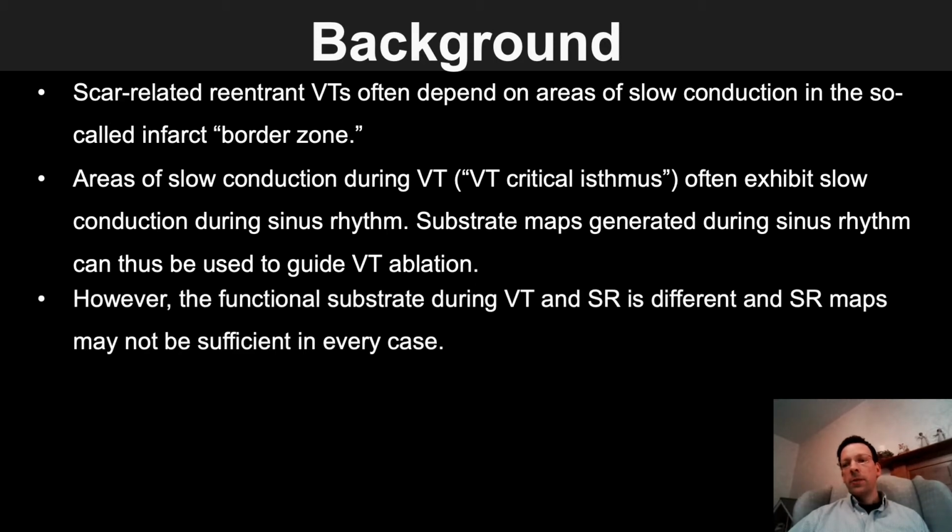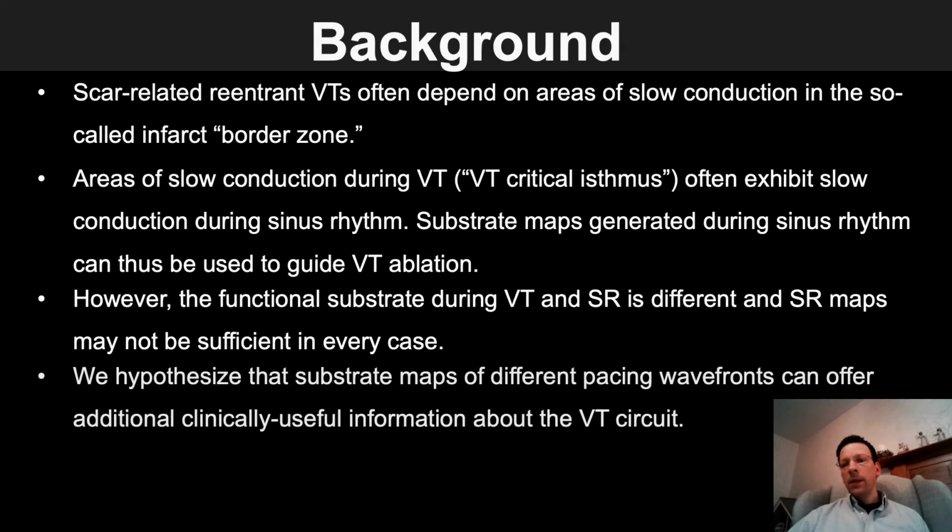However, the functional substrate is qualitatively different during VT than during sinus rhythm. Therefore, there is really no reason to think that sinus substrate maps alone will tell the whole story about the VT functional substrate, at least not in every case. We hypothesize that substrate maps generated with multiple different pacing wavefronts can reveal additional areas of slow conduction and thus offer additional clinically useful information about the VT circuit.